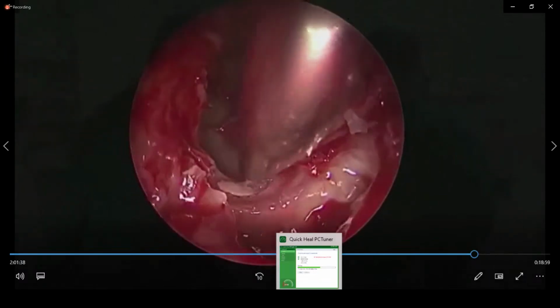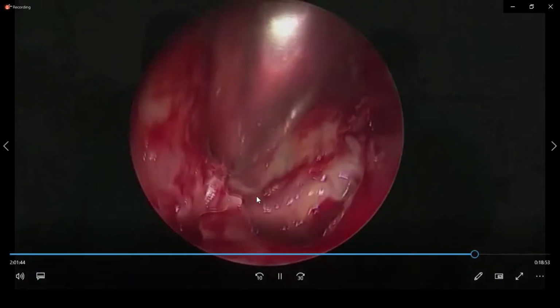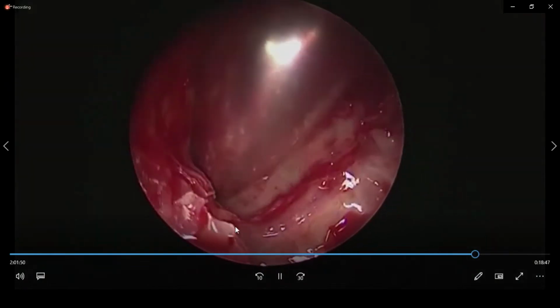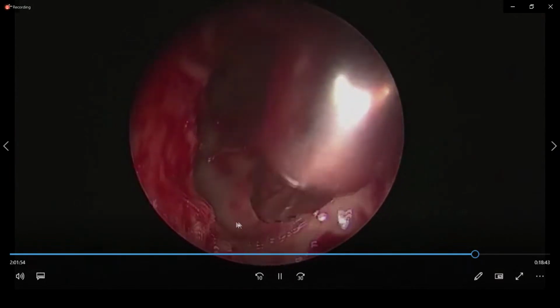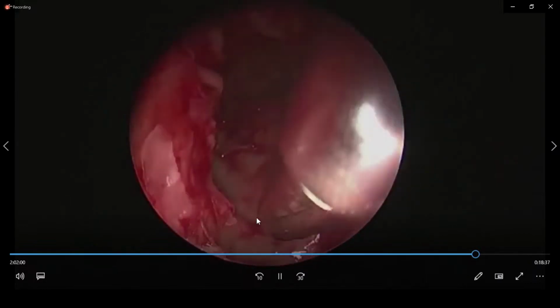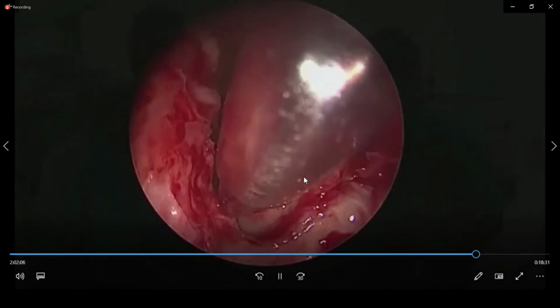See this septation I am removing with the skull base blade, same red 40 adenoid blade. And see, this is your artery here. So you can flush till the anterior ethmoidal artery. And this is the posterior limit of your supraorbital recess. The posterior limit of the supraorbital recess is formed by the artery. Bigger the supraorbital recess, bigger the artery, the more posteriorly the artery is displaced.